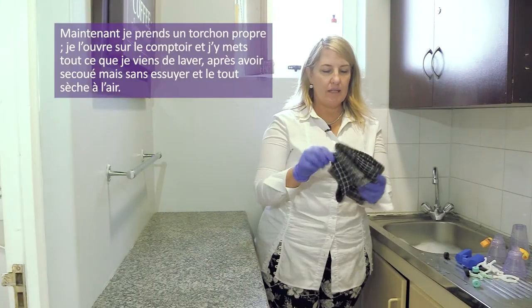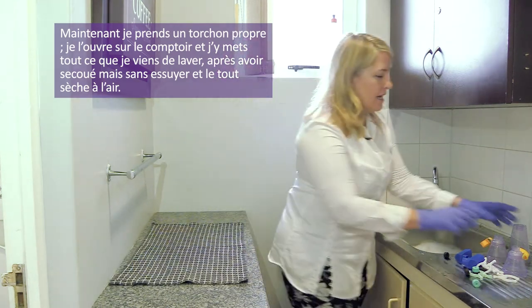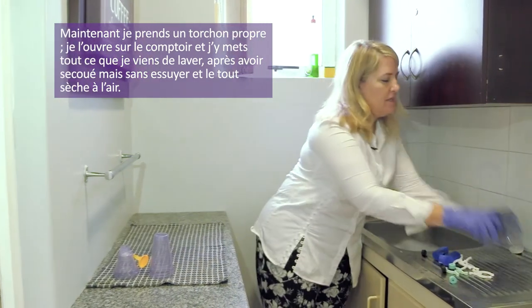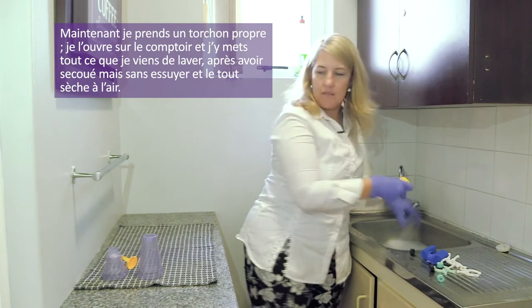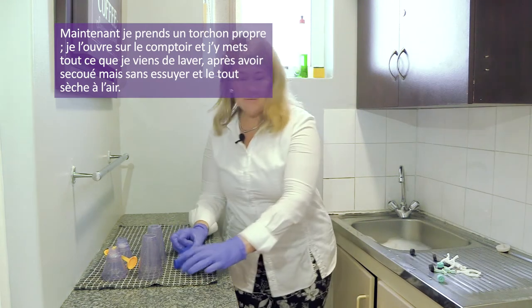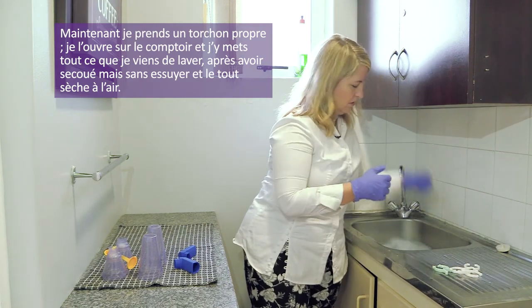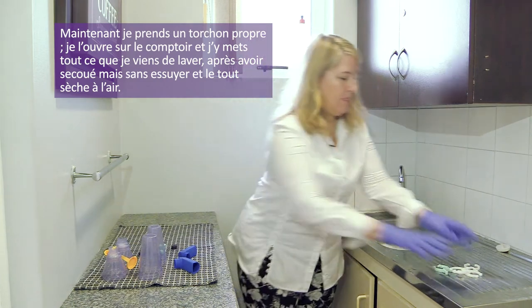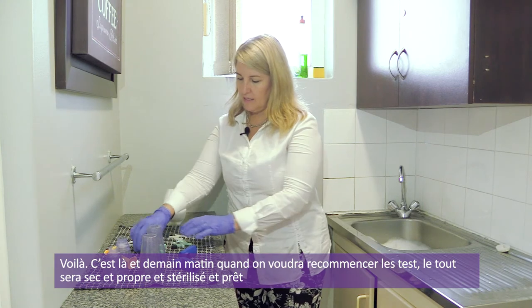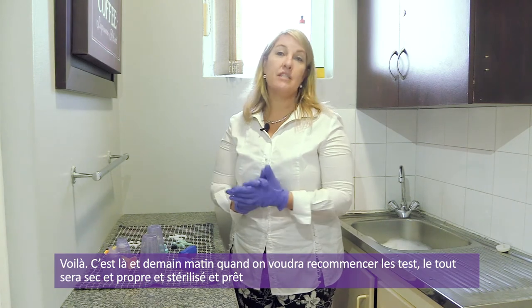I take a nice clean cloth and lay it out. I take my newly washed equipment, shake it off a little to remove as much water as possible — but not rubbing it in any way — and leave it out to dry. By tomorrow morning when we want to test again, it'll all be dry, clean, and fresh and sterilized.